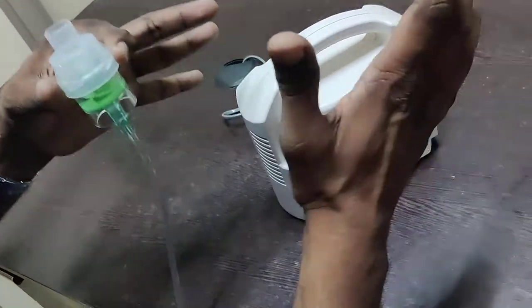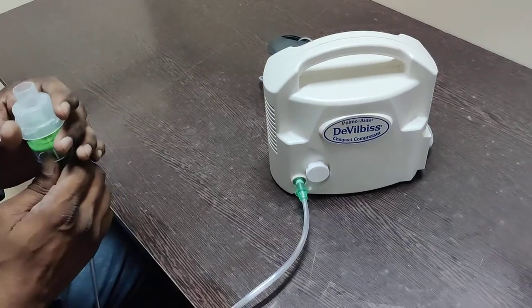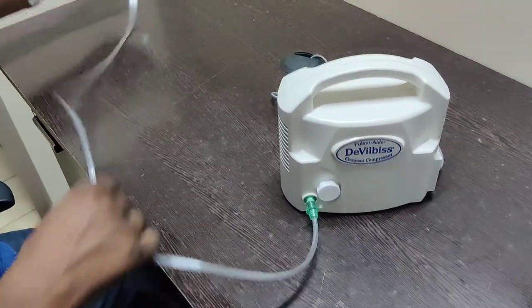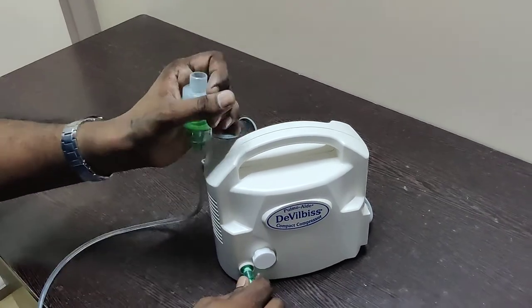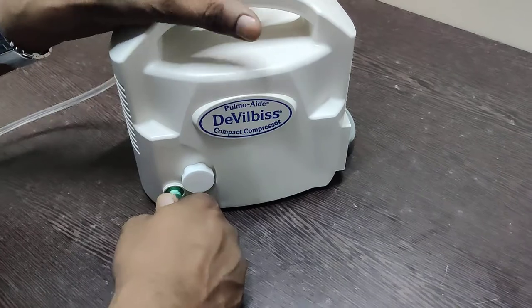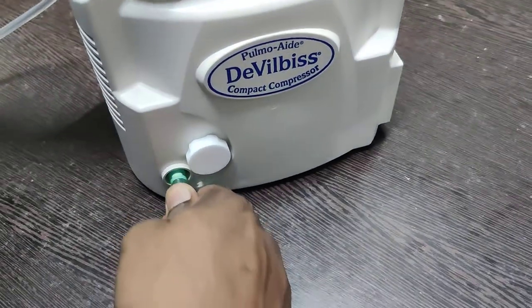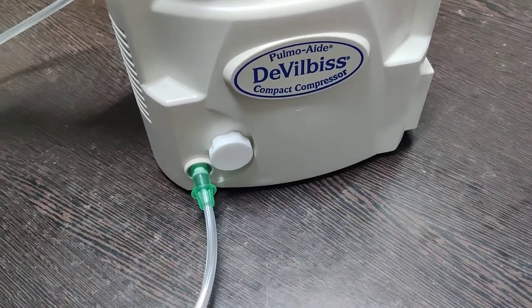It's a very simple device with just the on/off configuration. However, there are certain important considerations when operating the machine — specifically, how to remove the nebulizer tubing after use on a patient. Most people tend to pull the tubing directly, which is not the recommended way of removing it.